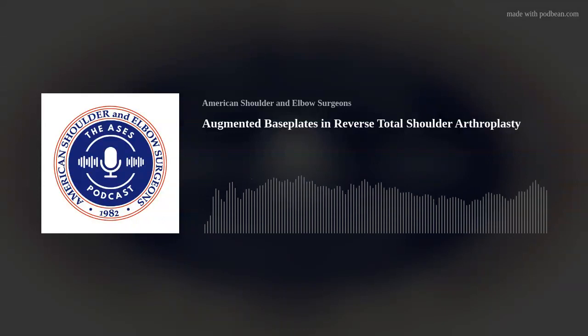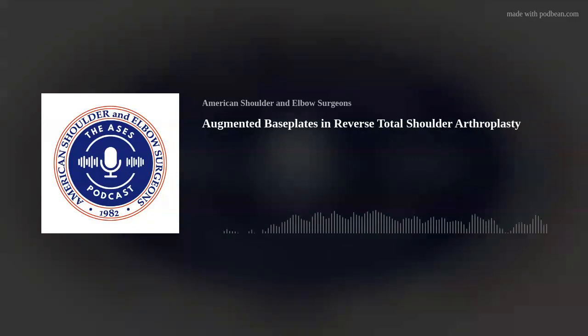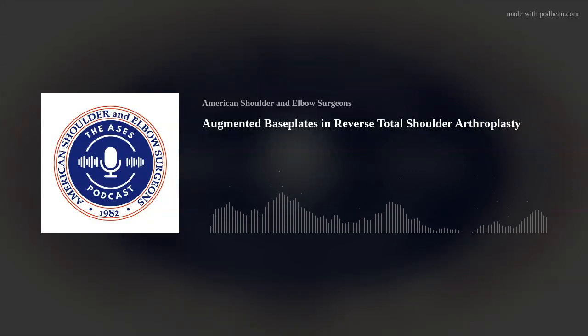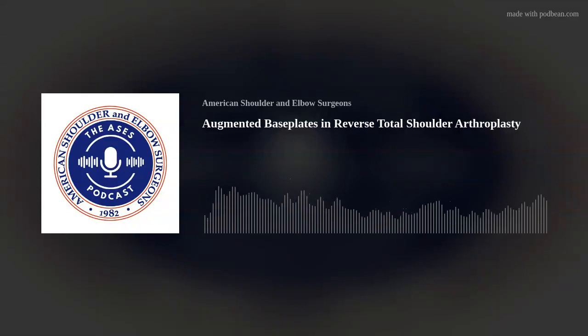They have good hard sclerotic bone. Sometimes on preoperative planning, you can get version and inclination and have a better sense of it with some of the programs nowadays, even with metal in the head. But I find that these patients can actually do pretty well off the shelf.